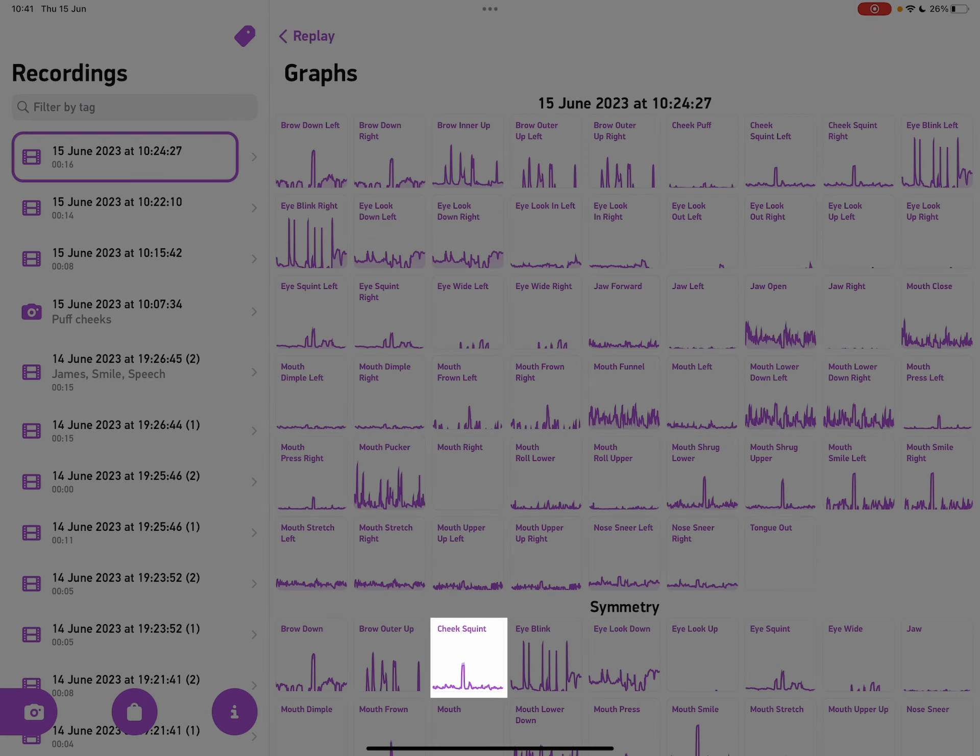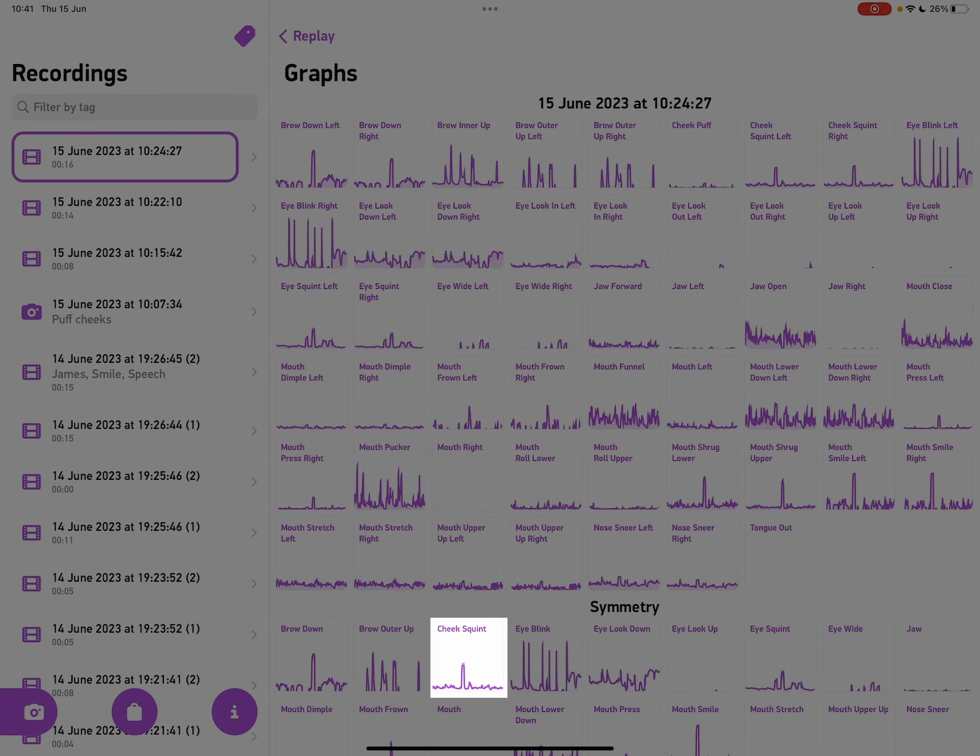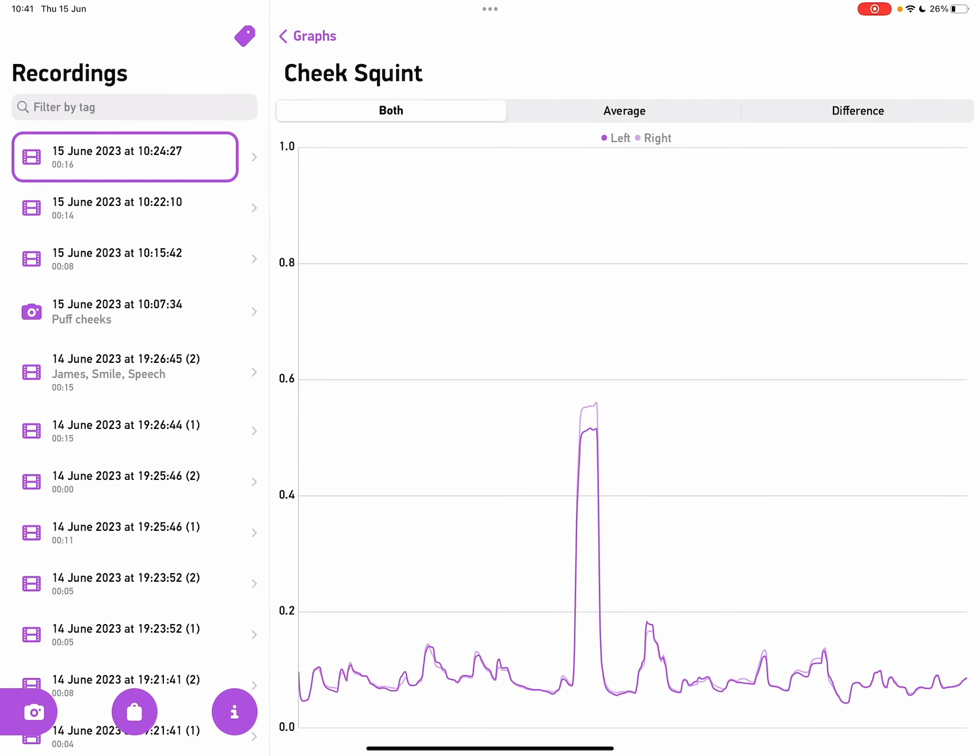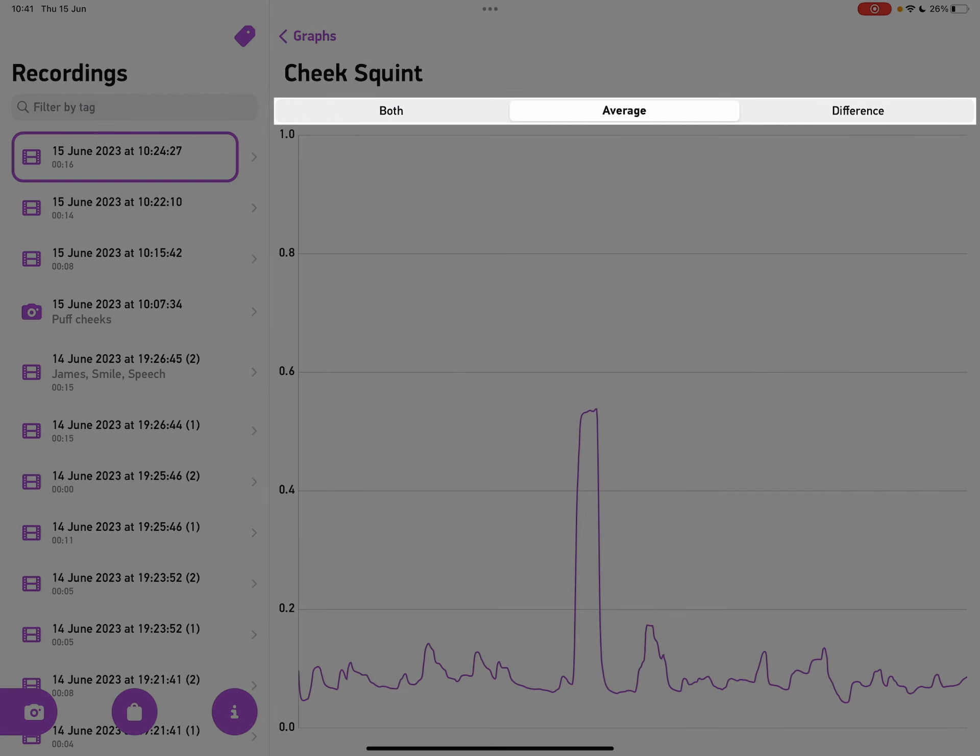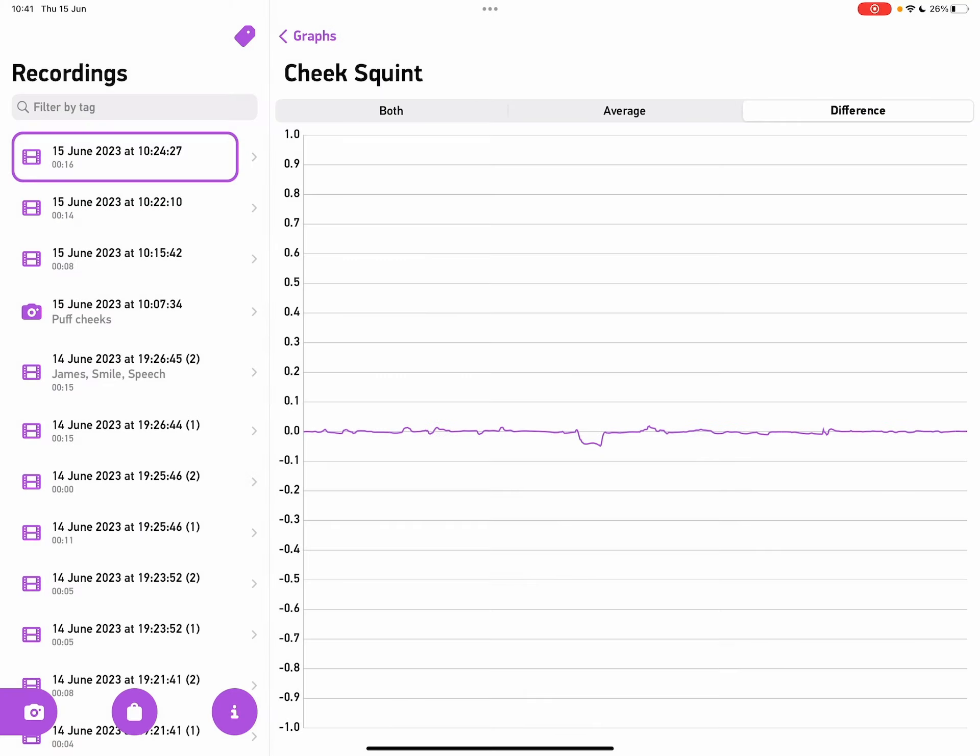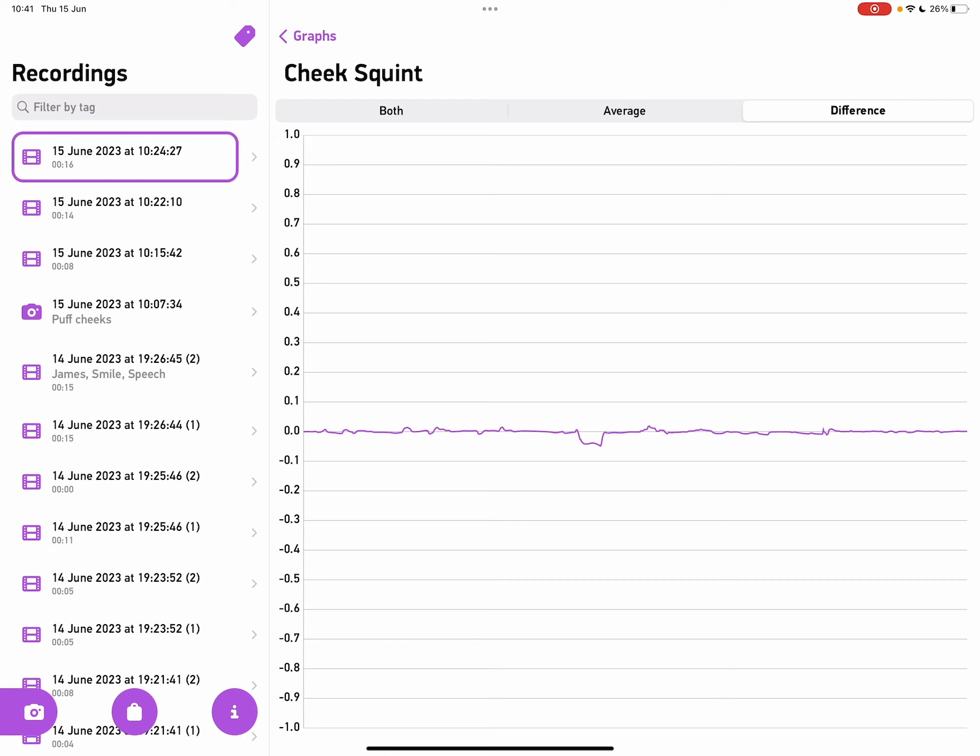If I tap on one of the symmetry graphs, we can start to analyze the symmetry of this location. For example, we can see an average of the values, or we can see the difference of the values in case there's a bias.